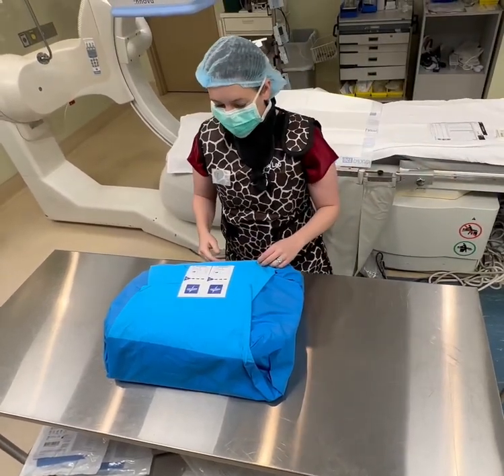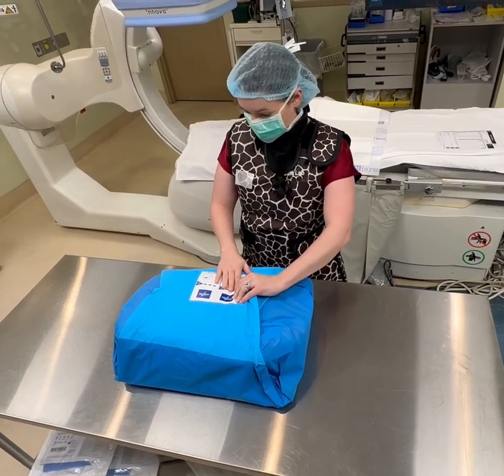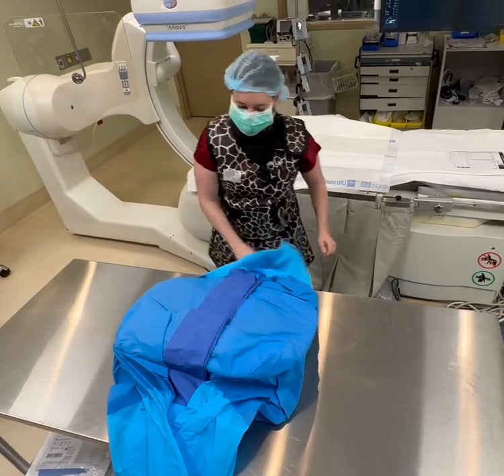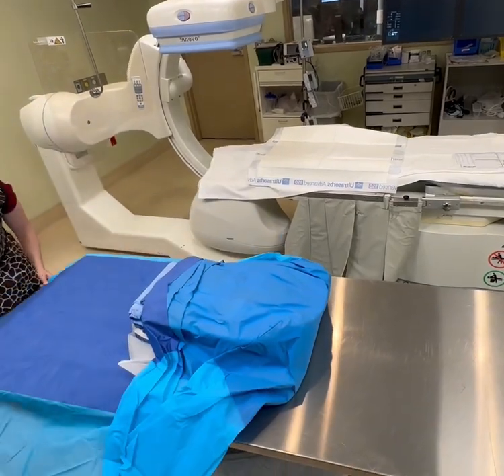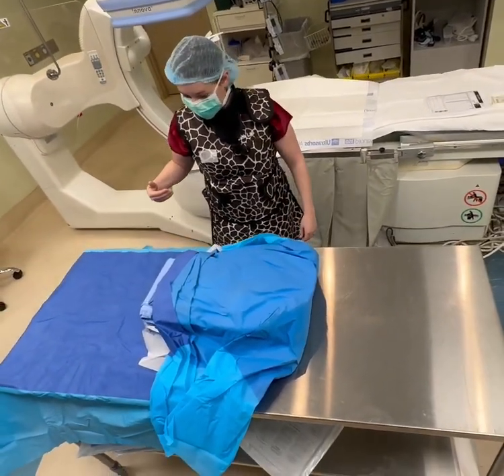All right, I'm going to turn around. And what am I going to open first? I'm going to open the flap furthest away from me first, okay? So tear it. Open it. Pull it out. You can touch here because initially this is going to hang off the side of your table, okay? Pull it down. You're going to maintain a 2-inch buffer the whole time because you're not sterile yet. All right?